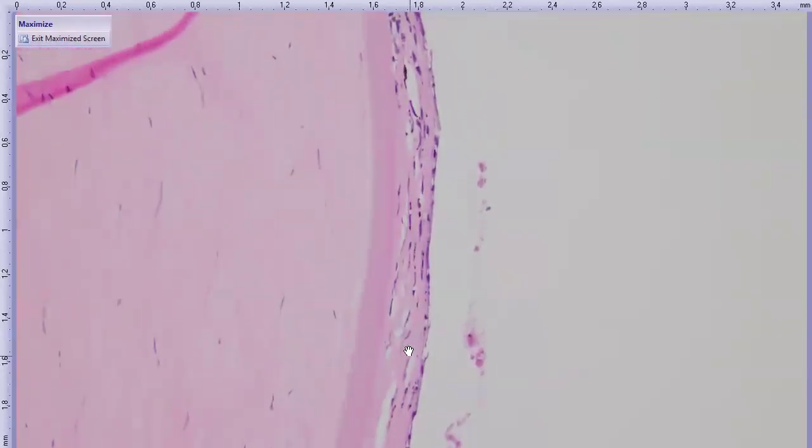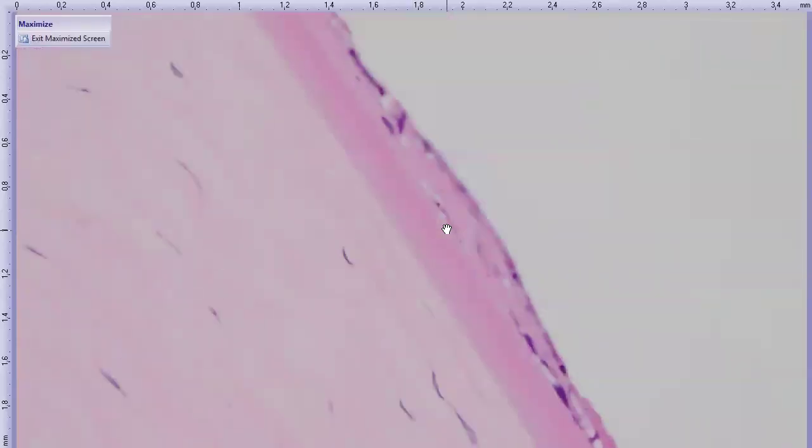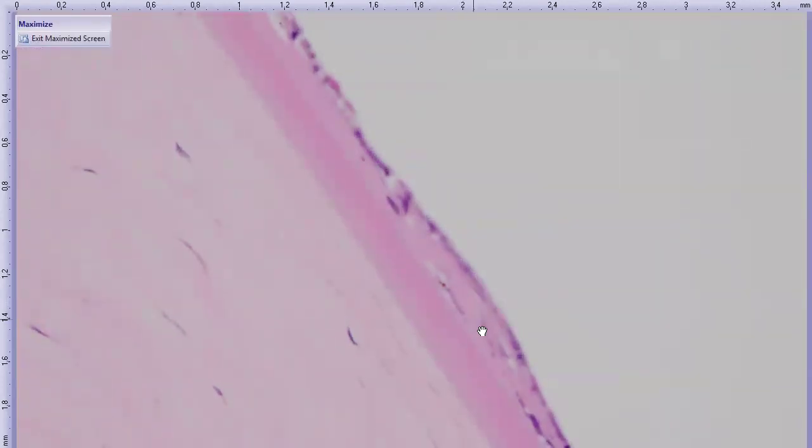And similar to the membranes on the iris, we've got these membranes and doubling of the posterior cornea, of Descemet's membrane. Sometimes you can even pick up some pigmented cells in between these layers. So there are probably collapsed ruptured cysts on the posterior cornea here, which they were appreciating clinically as well.